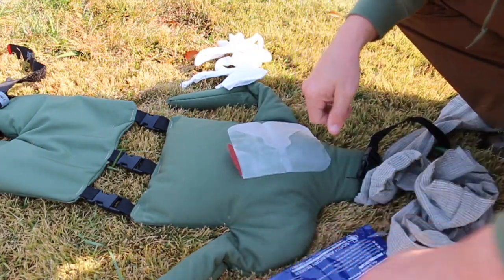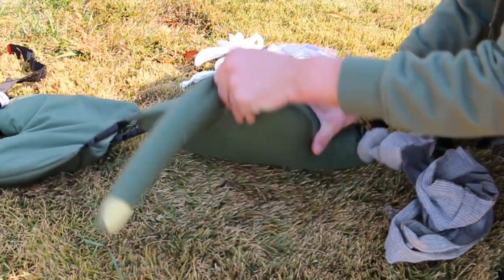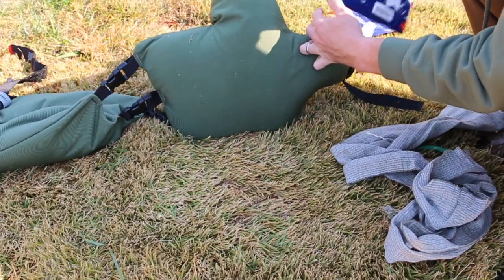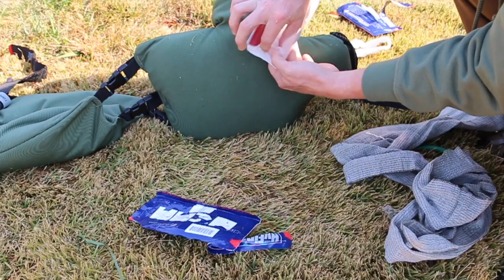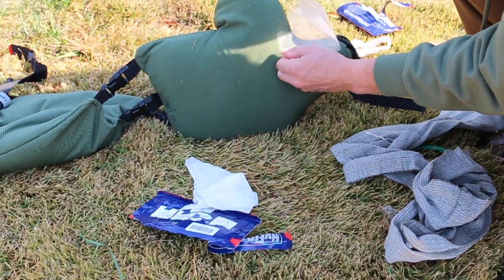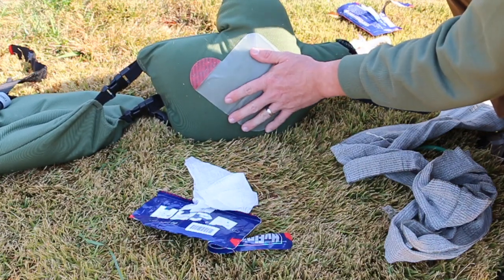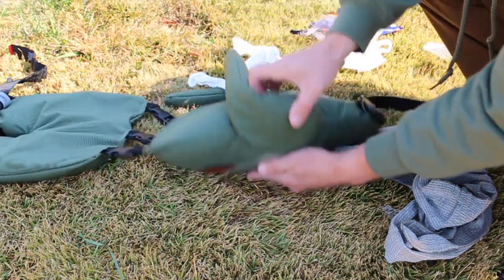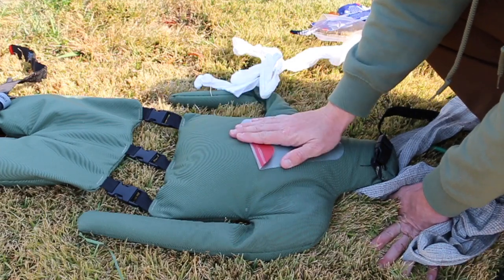Ready to go. Now, because we have an entry hole, we want to log roll the patient and make sure there's nothing on the back side as well. If there were something on the back side, then we pull another one out, pull the red tab again, and slap it on here. Now, it's not going to vent back here because your patient is laying flat. So the only one that's actually going to vent is the one on the front. So get that taken care of.